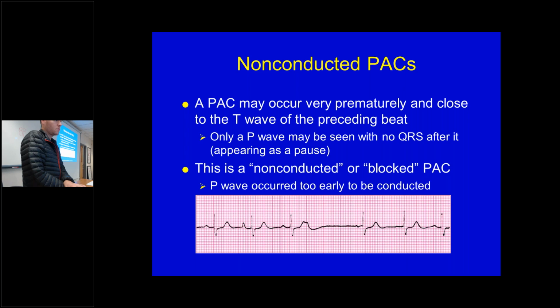It's normally not just like a one-time event, though. Does that indicate disease or some other cardiac problem? No, I mean that's just a PAC that happened too soon. Okay, so everything else is good. I mean, it would be the same, at least from a prognosis standpoint, as your normal PAC. It's just that it happened too early in repolarization, so you didn't get a beat from it. You might feel that maybe a little bit, if you were more sensitive, just because you don't get the beat.